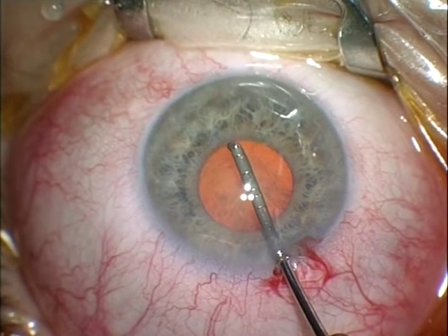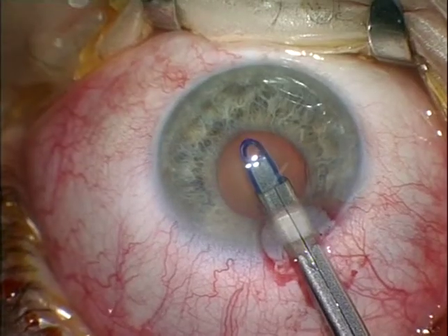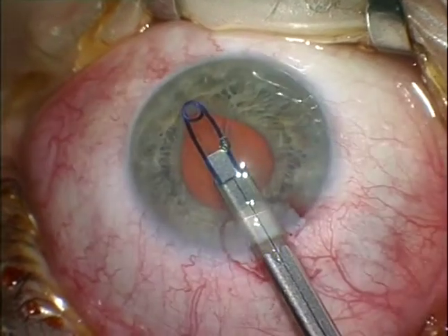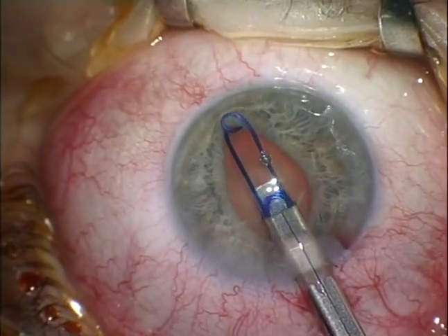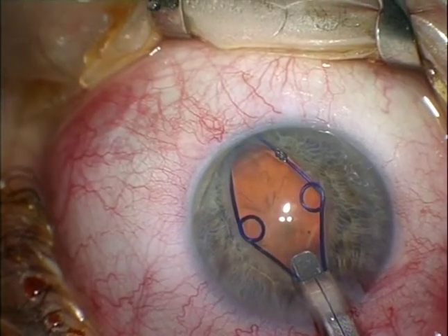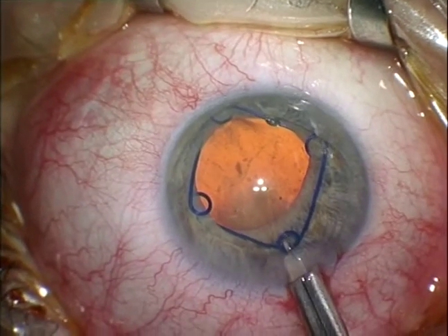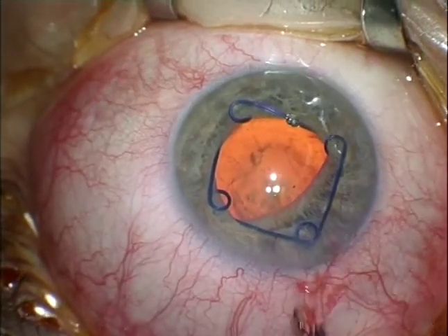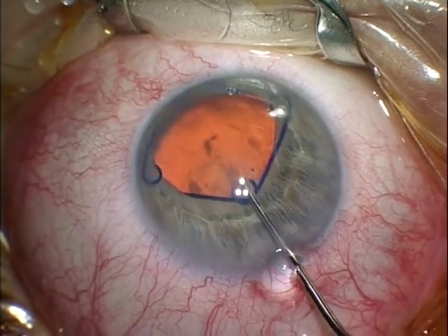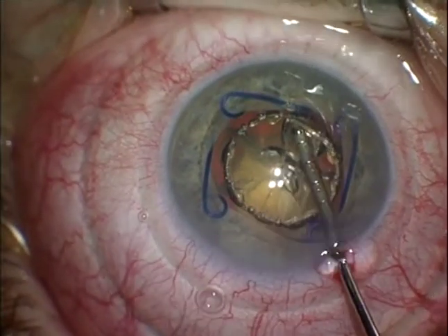And of course, we will need a pupil expansion device in that case. We will be using the Malugin ring in the classical version. With the injector, we are inserting that device inside the anterior chamber, catching the iris with the 3 scrolls of the device and utilizing the ring manipulator to insert the last scroll located close to the main incision.